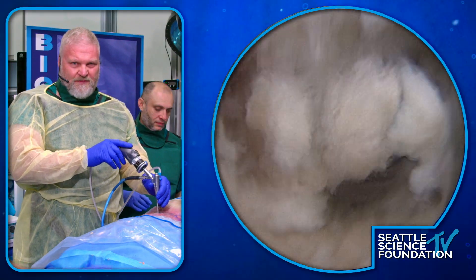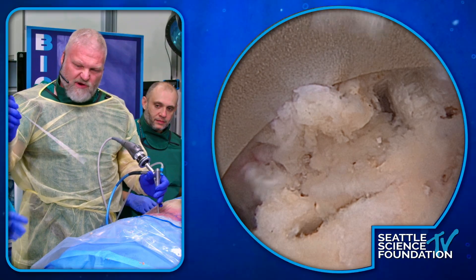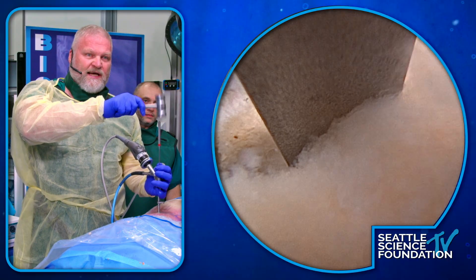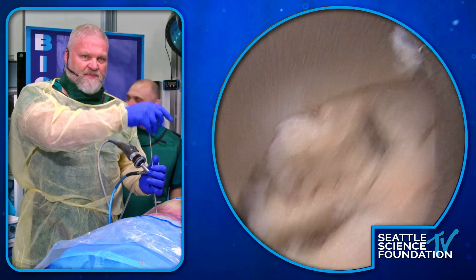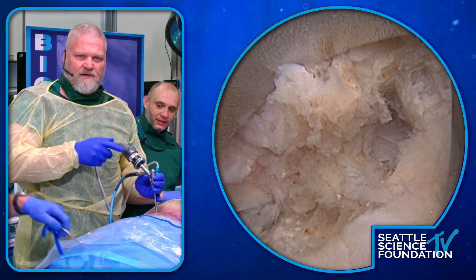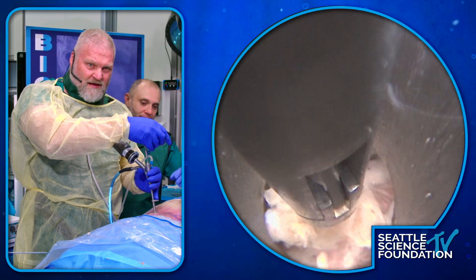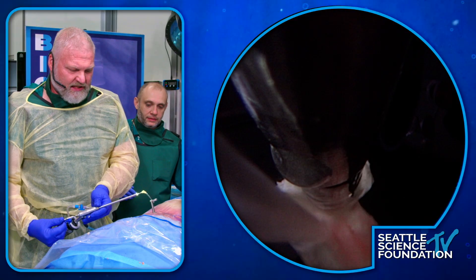Let me find one other spot that has something like that. Here's some bone — I'll take a straight one. This is kind of where Chole was going after it. It does the exact same thing — you can feel where the release is on the back side, so when it goes through it releases. You spin it and it breaks off in one big chunk. Ray, you mentioned that piece of bone — hold on — see that piece of bone? I can't reach, I need a longer pituitary. Now I grab that piece of bone and pull the whole thing out. There we go.